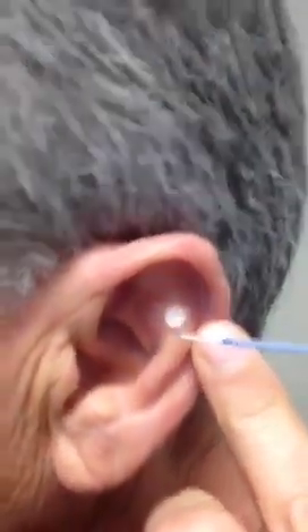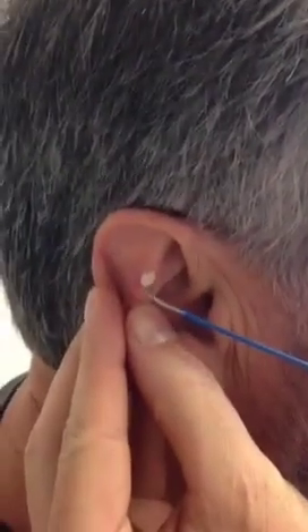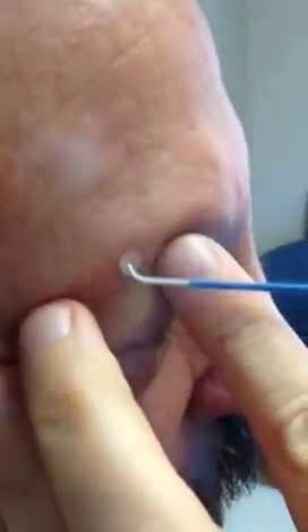Somebody wants to know if that hurts. No stinging sensation — says the man through a very controlled voice. It does sting. All those hearts are from people liking what's going on. I guess they like you hurting! We're going to hit this one again, and then after it thaws we'll hit this one again. This should not need to be done again for these lesions, but in a person who gets actinic keratosis, chances are they're going to happen again.